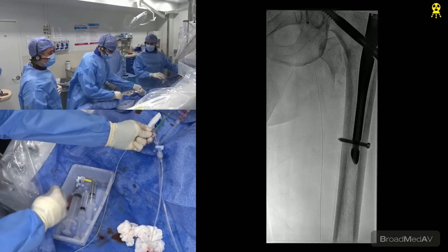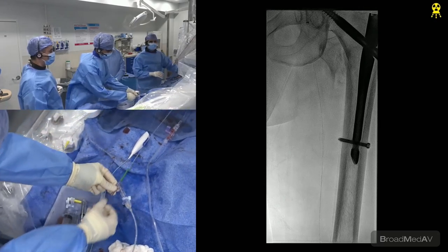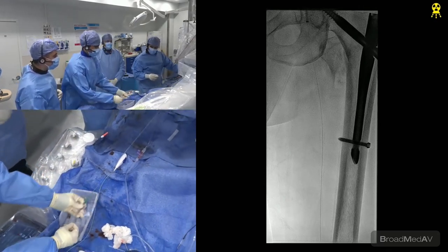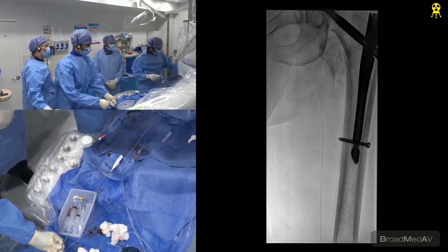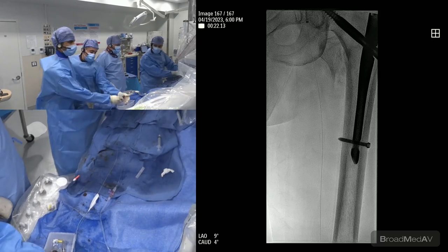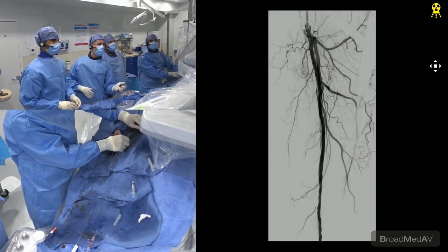Obviously you could talk about Tack stents, other stents, but we don't use that. Nope. I think it's a great stent. It's got a role in what we do, but not really for our lab. We have so many stents. So at this stage, we're just going to go ahead and take a picture and then physiologically treat this. So what is the pharmacotherapy post?